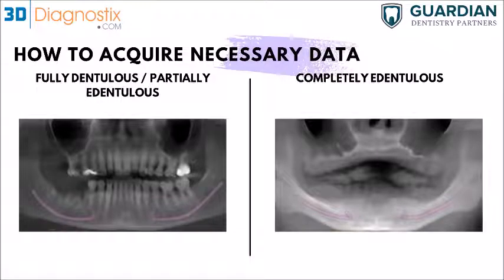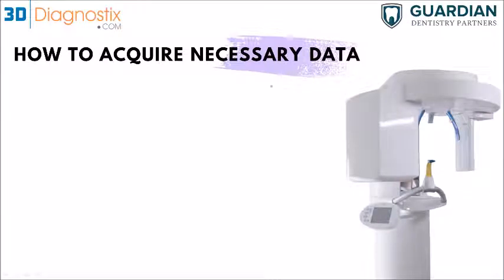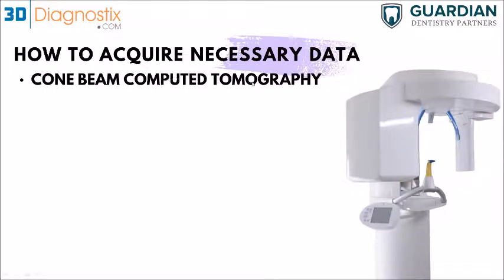Before you scan the patient, make sure that the denture is relined. We're going to talk about that in more detail moving on. Again, the difference is that you take the scan with the patient wearing the appliance, and then you take out the appliance and scan it alone. So you're going to have 2 sets of DICOMs sent, and with those 2 sets of DICOMs, we're going to be able to stitch them together. And I'm going to show you how we do it right now.